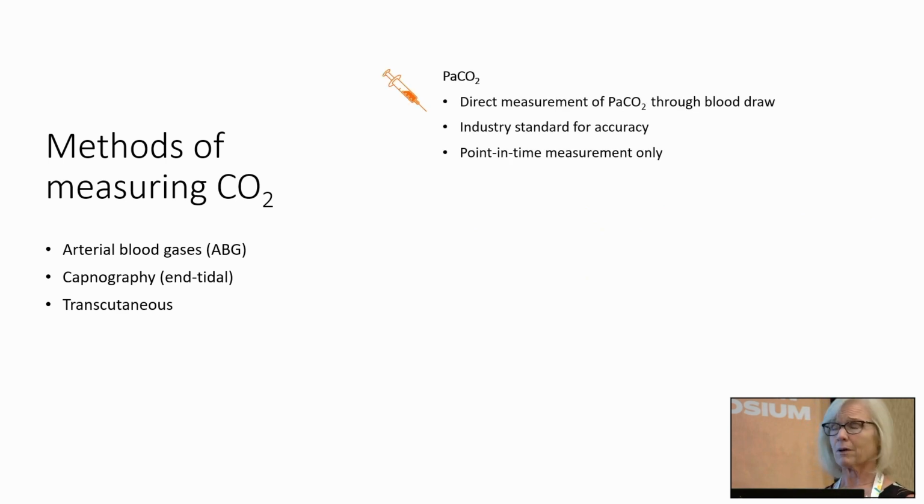So, all right, Margie, we get it. We should be looking at the CO2 a little more closely. Yeah, we should. How are we looking at it? A couple of different ways. We are looking at the blood gas. Of course, that's going to be your gold standard. That's always going to be the gold standard. But it's just a point-in-time measurement, so we'll talk about that in a little bit.